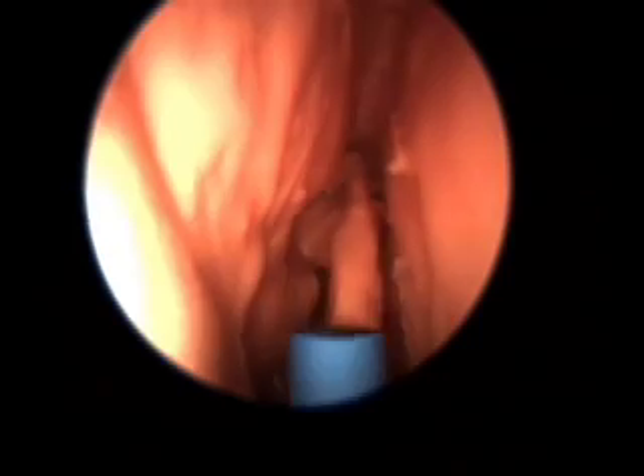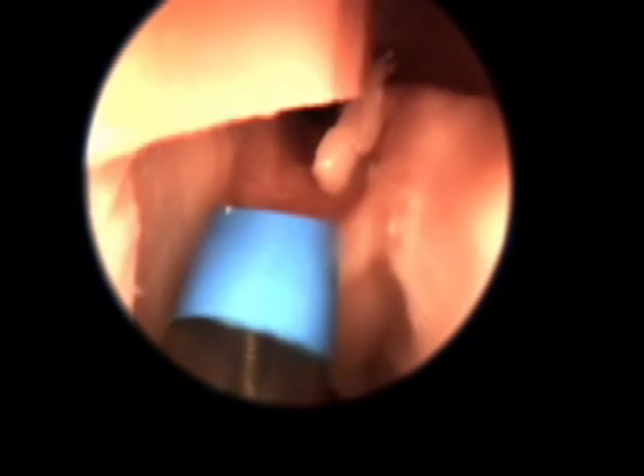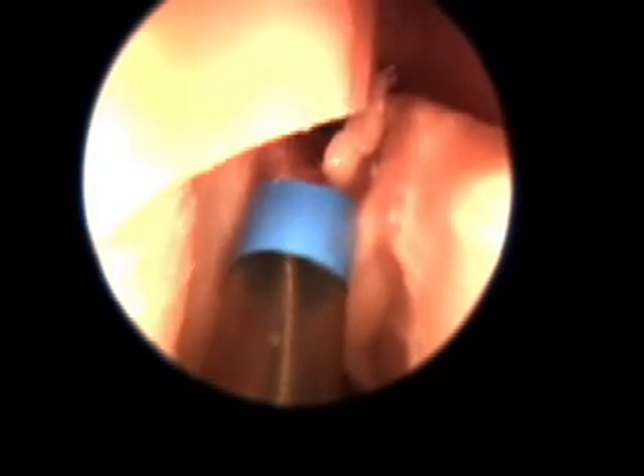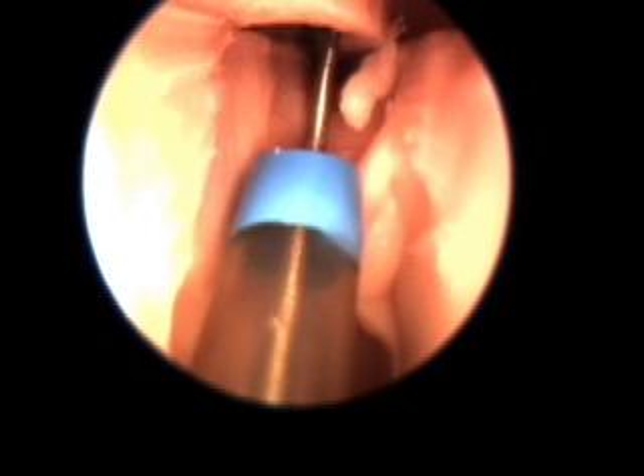Here we are inside the right nasal cavity about to perform a balloon sinuplasty of the right frontal sinus. Right now, the guide is being positioned to allow a probe to identify the opening into the right frontal sinus.